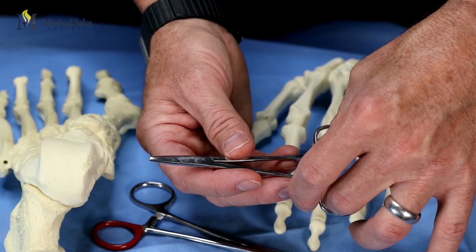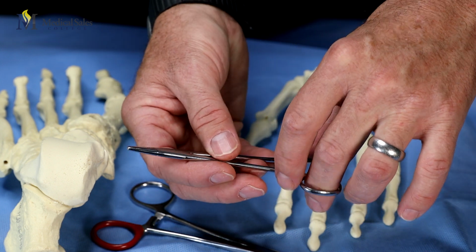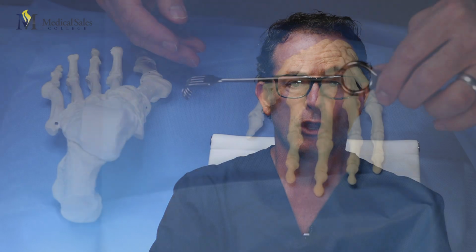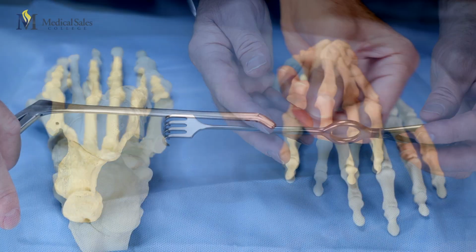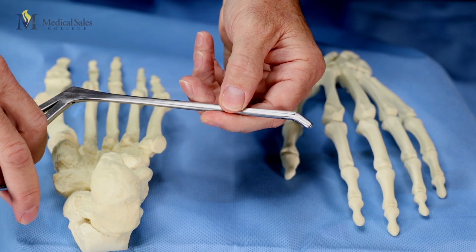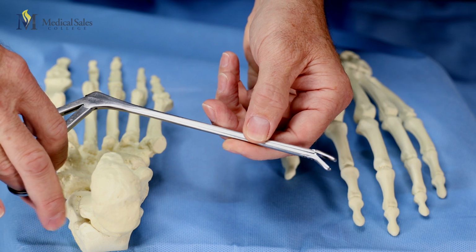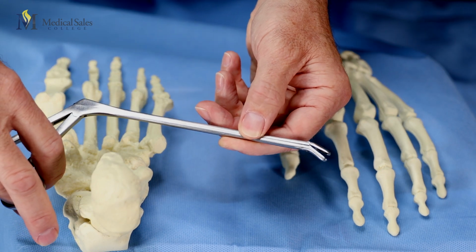Needle holders will also fall under the clamp category, and they are used to grasp and firmly hold the needle at the end of suture when we repair incision sites or closure of tissue. Retractors help retract or clear the visual field. Rongeurs are aggressive, grasping type of instruments that help remove soft tissue and or bone from the operative site.